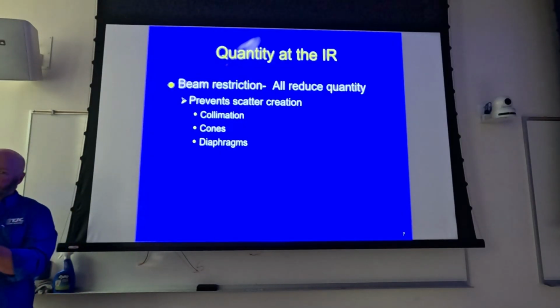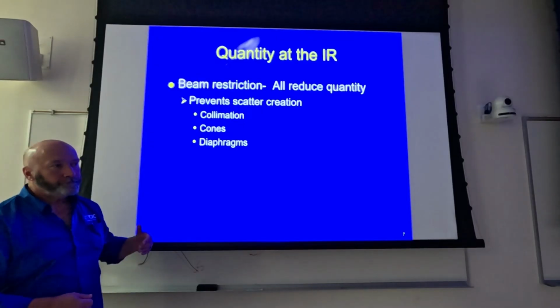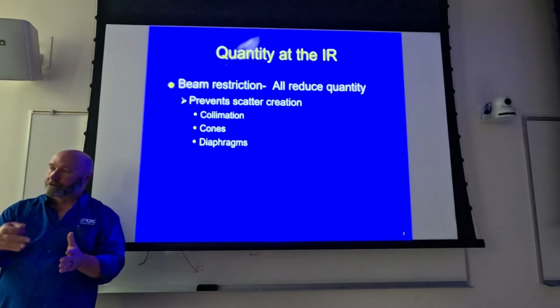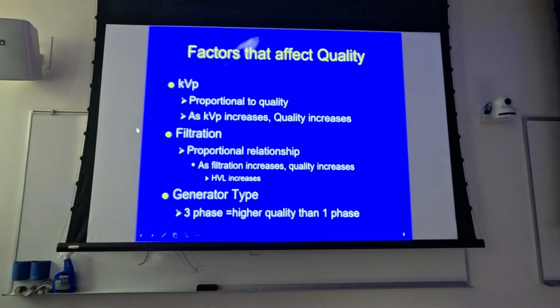And then collimate down to just what it is that represents a bone and shoot it a second time, and see what your AECs give you on the second collimated image. It should increase, and it should increase because as you increase your collimation, you're going to lose image receptor exposure. So it also prevents the scatter radiation from being created, which also adds to your index number.